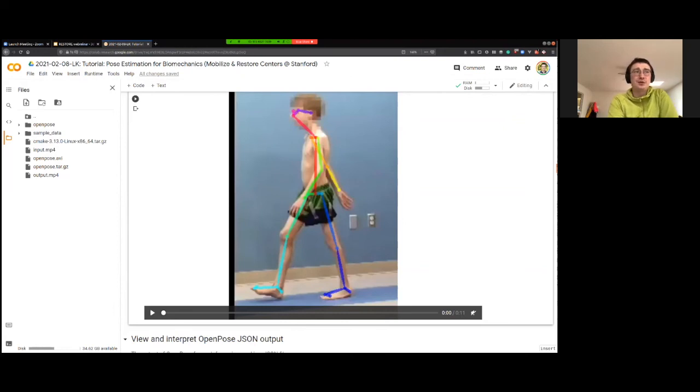So I wouldn't say that the OpenPose is, well, it's a correct conclusion that the OpenPose is not that good with replicating motion capture, but we showed that this can be denoised with some deep learning on top of that. And the OpenPose is not the only tool here, so we could definitely build better tools, and that's the hope.